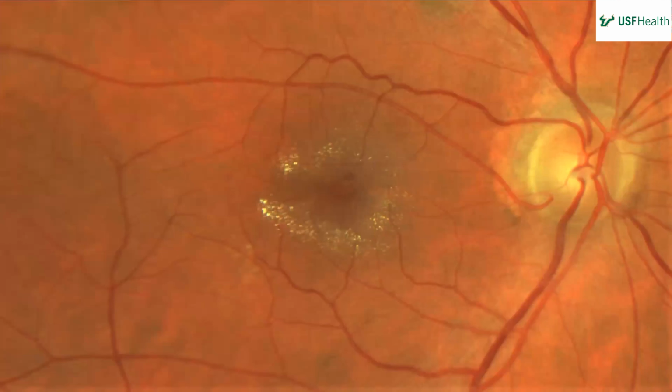So what do you see there, Sam? All right, so color fundus photo of the right eye. I was really hoping this was going to be a cataract, but it looks like we've got some retinal pathology going on. The vitreous is clear. The disc is completely normal. Your attention is drawn to the macula, which has some yellowish deposits parafoveally, possibly inferior to the fovea. There's also some yellowish deposits along the inferior arcade. Otherwise, everything else looks pretty normal.